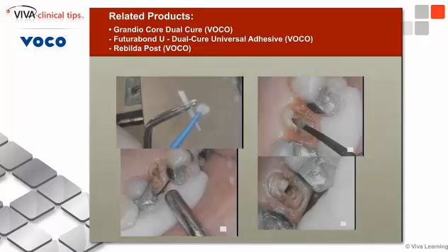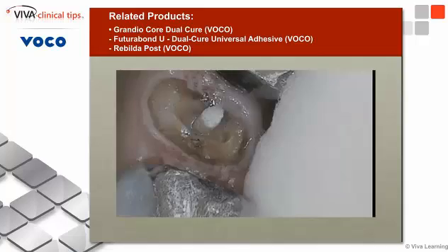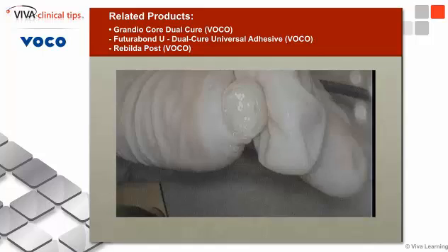I then go in and place the bonding agent — and these are different materials, so I don't want you to think it's the same thing. I dried it off, let it cure, placed the build-up material into the tooth, and then placed the fiber post in. There we have the post inside the canal.